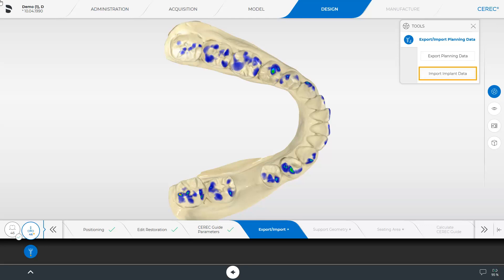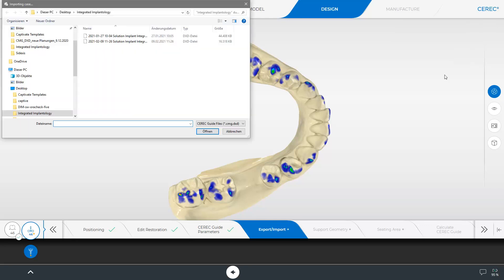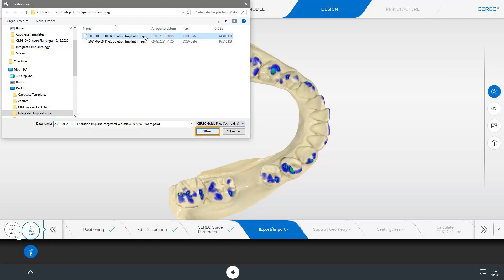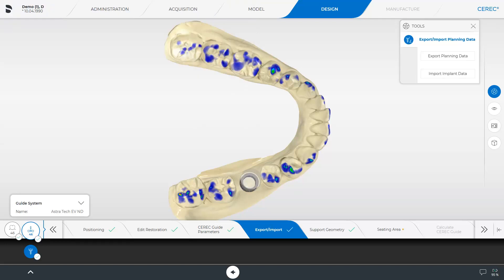By clicking Import Implant Data, we can access our drives. We select the corresponding folder and open the file in CMG-DXD format, which was previously exported from CEREC Implant. Once the import is completed, we can proceed in the Step menu.